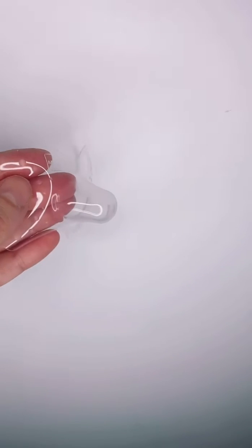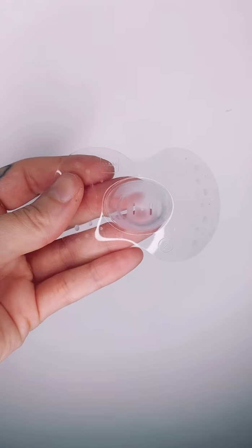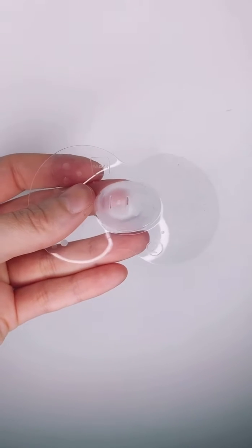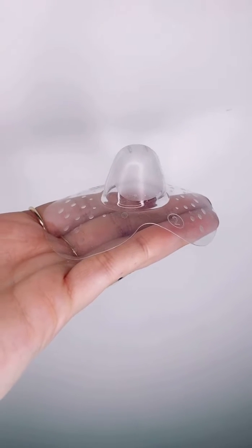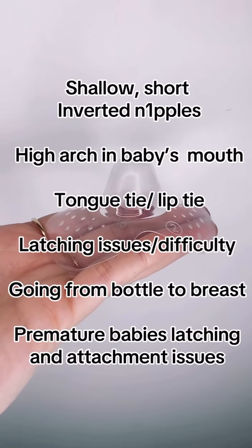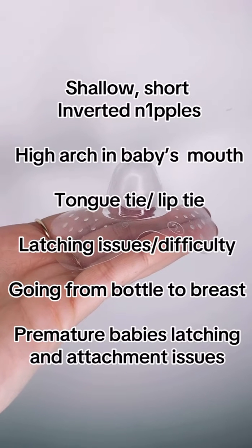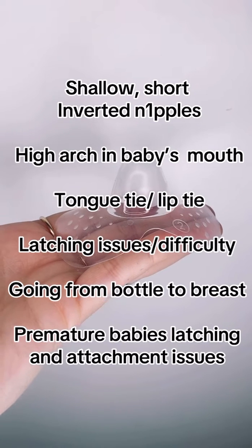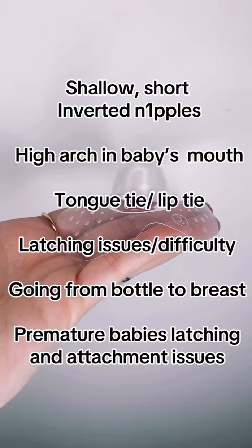Nipple shields are small little silicone devices that can help with your feeding issues that you may be experiencing, and they can help with various different conditions. Nipple shields are most commonly used if you have flat nipples, inverted nipples, small nipples, if baby is having latching issues and is slipping off the breast, if baby is used to the bottle and is trying to come back to the breast, and various different more.